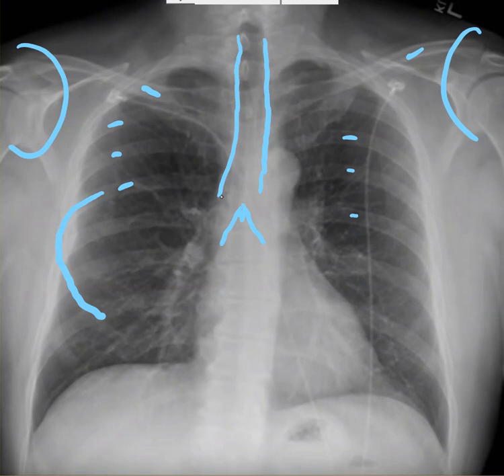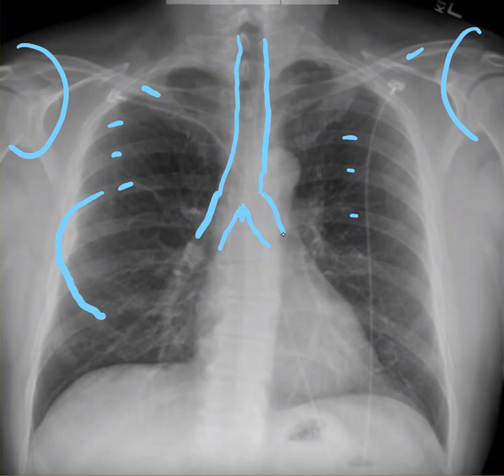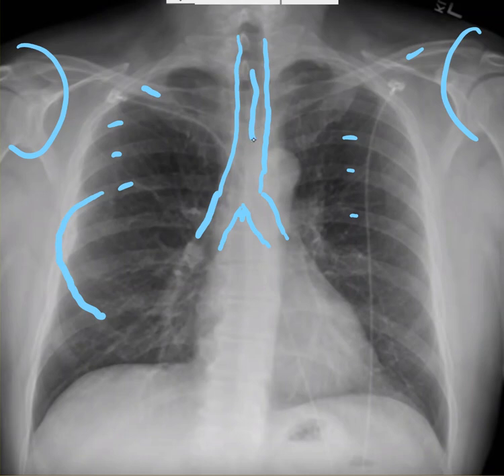You have the right main bronchus coming off right here, and of course the left — which is a bit harder to see — comes off on this side. If you're looking for ET tube placement, you want the ET tube to be approximately five centimeters above the carina, somewhere up in here.